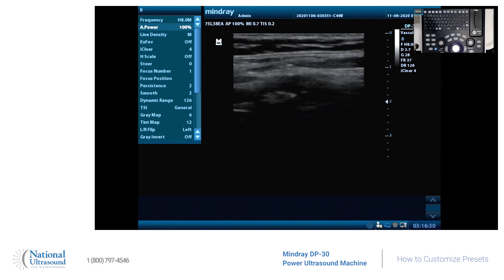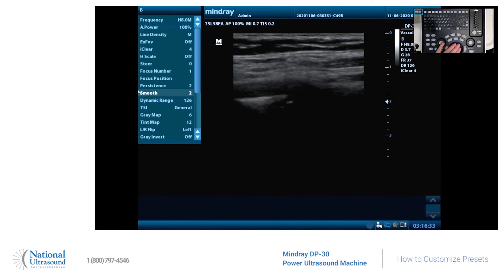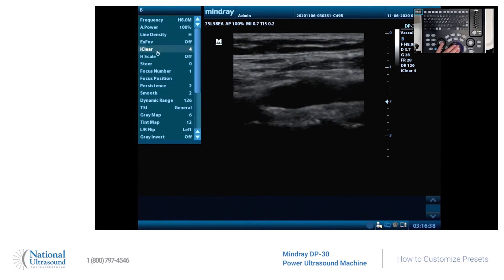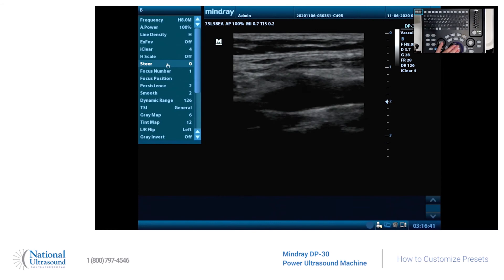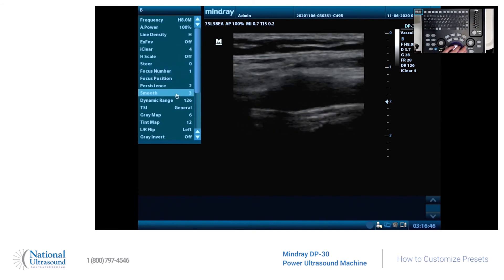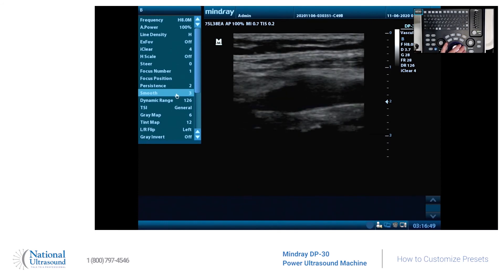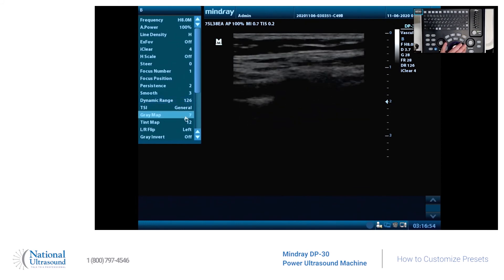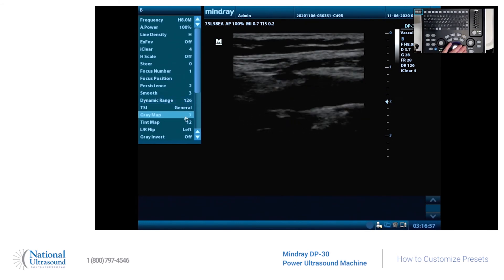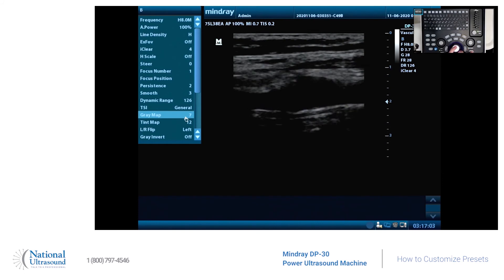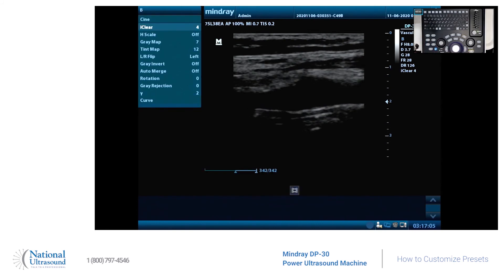And also, let's change this line density to high. We can change the steer and focal numbers. Smooth — I like a little bit smoother. This is all preference-based, but I changed the smooth. Dynamic range you can change, and you can change the gray map. I'm more of a cardiac sonographer, so I like the true contrast images, but you can easily customize to your preference.